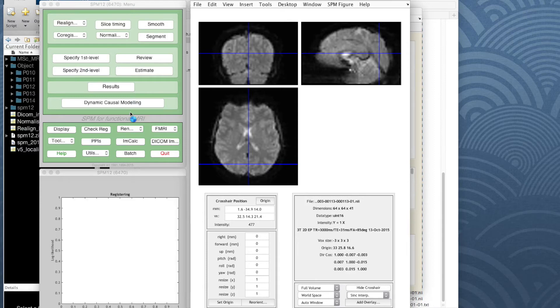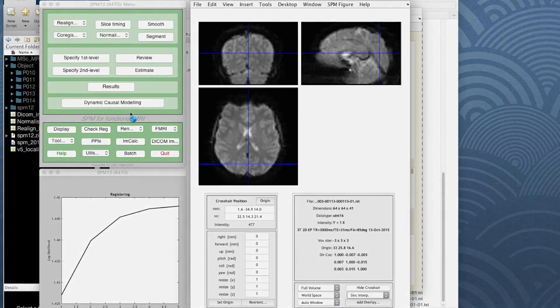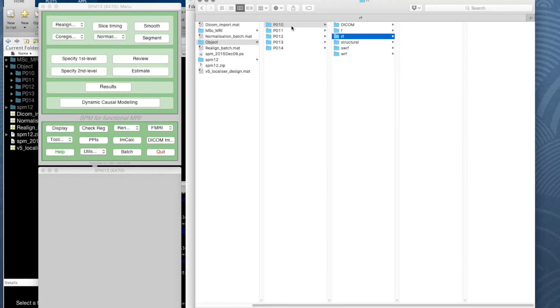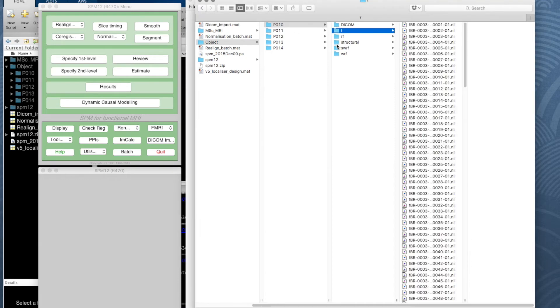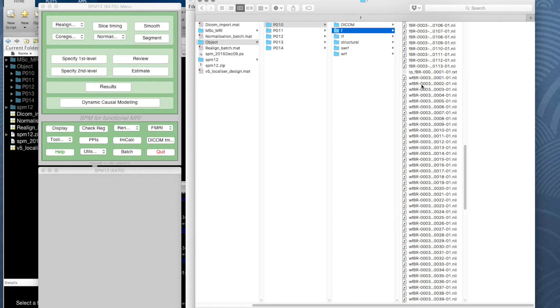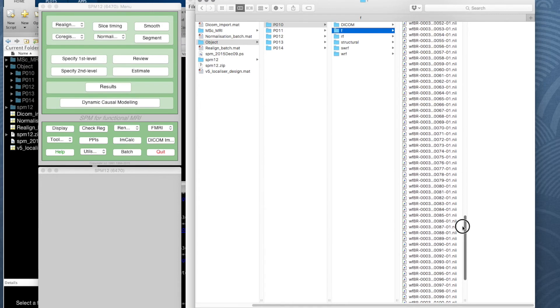Once normalization has completed for all participants, you should check that it's done it correctly. If we look at participant 10's functional directory, we've still got the functional images which were realigned. We now see there's an additional set of images prefixed with a 'W', which means warped — the images have been warped to match a template.